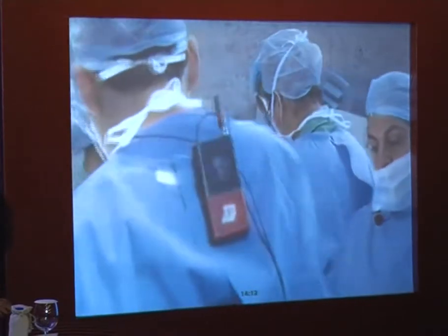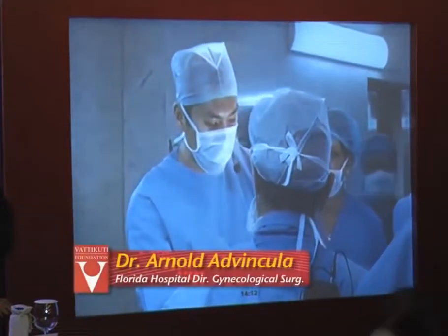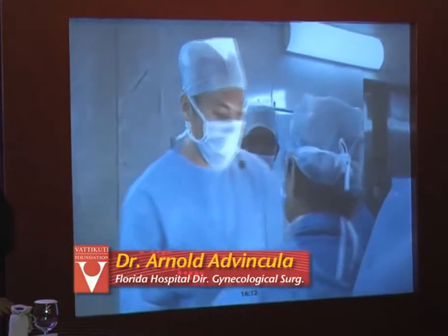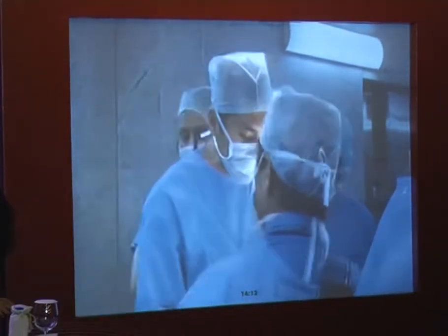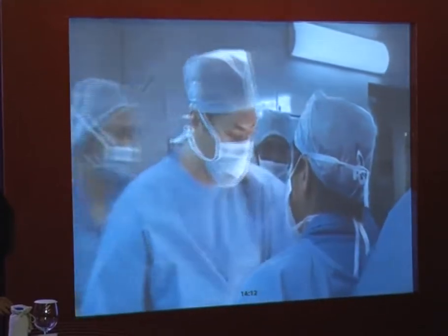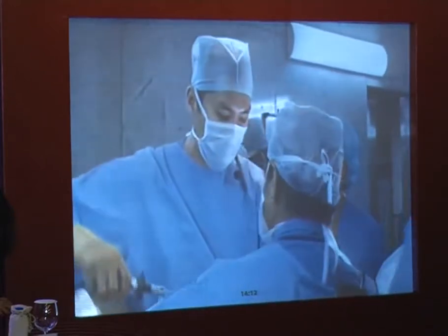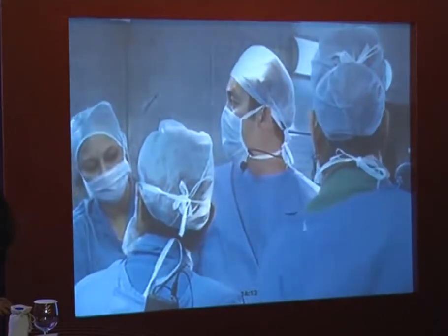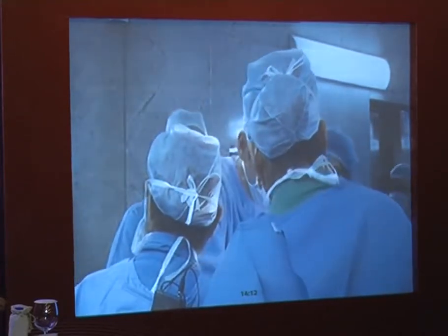We are about 3 finger breadths above the umbilicus, which is just beneath the falciform, she's so petite. Arnie, the audience has a request here. They want the external camera to focus on the abdomen while you're talking so they can actually see you placing the ports. I know you said you'd show the ports after all of them have been placed, but there's a request to focus on the abdomen. Do we have a camera that we can show? Well, we're just about finished putting them in, actually, so by the time he gets the camera, I think we're going to be done.